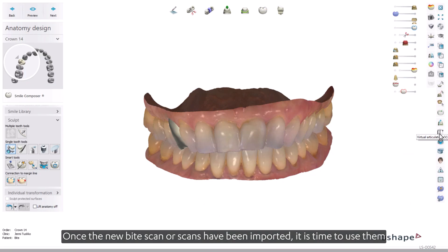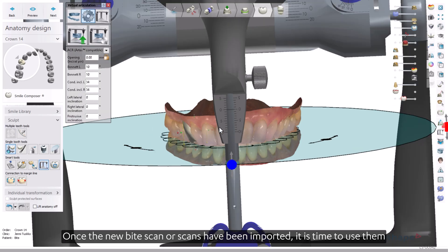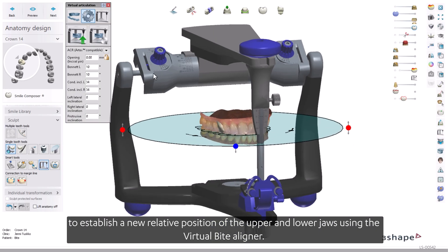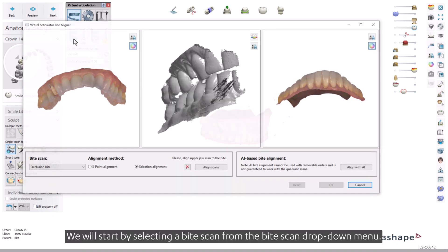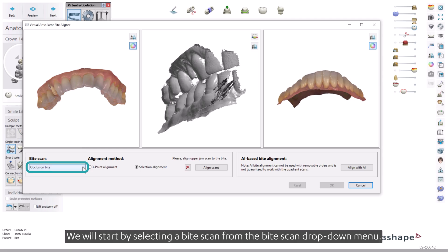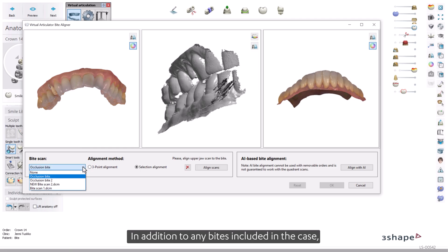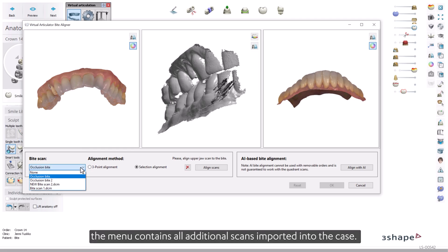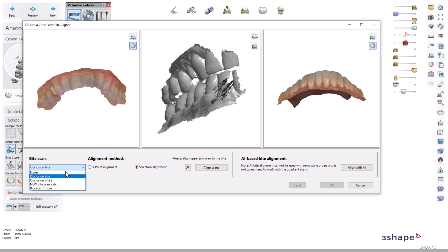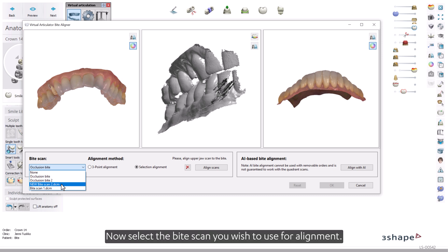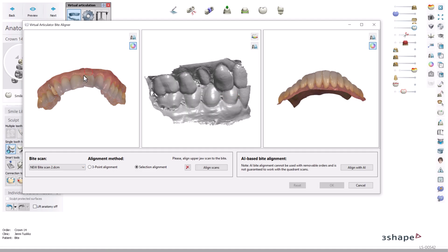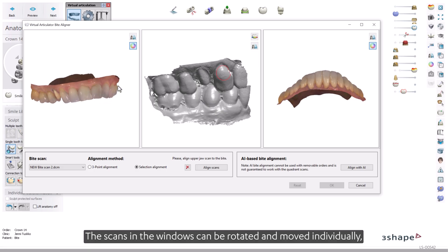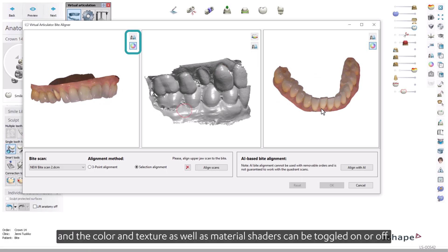Once the new bite scan or scans have been imported, it is time to use them to establish a new relative position of the upper and lower jaws using the Virtual Articulator Bite Aligner. We will start by selecting a bite scan from the Bite Scan drop-down menu. In addition to any bites included in the case, the menu contains all additional scans imported into the case. Now select the bite scan you wish to use for alignment. The selected bite scan should appear in the middle window. The scans in the windows can be rotated and moved individually, and the color, texture, and material shaders can be toggled on or off.